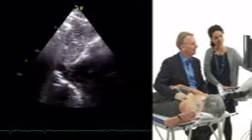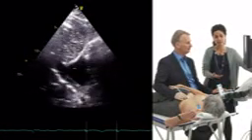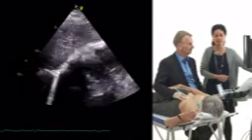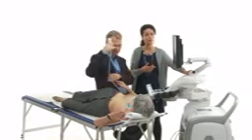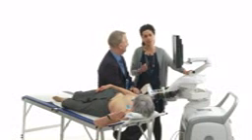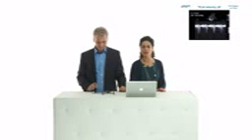It collapses completely. Okay, so what does that mean? It means that the pressure in the right atrium cannot be more than 5 millimeters of mercury, and when we add this value to the previous one, 25 millimeters of mercury, we get a maximum systolic pulmonary arterial pressure of 30 millimeters of mercury. So normal pressure. But now let's practice with a clinical case and assess systolic pulmonary artery pressure in this patient.